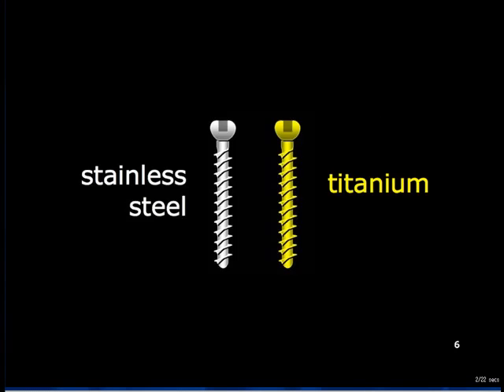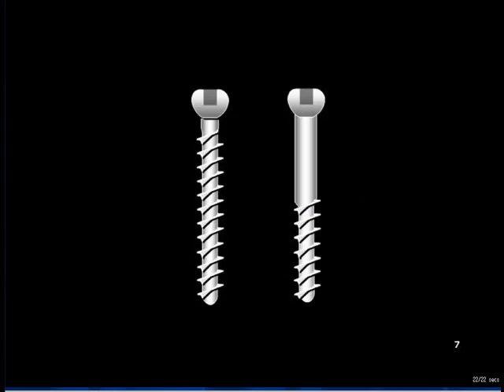One of the basic attributes of surgical screws is the material of which they are made. Most are metal, either stainless steel or titanium, these being inert, or virtually inert, in the body tissues. Of course, biodegradable screws are made of a variety of materials that are not inert in the body tissues, as they are designed to be absorbed slowly.